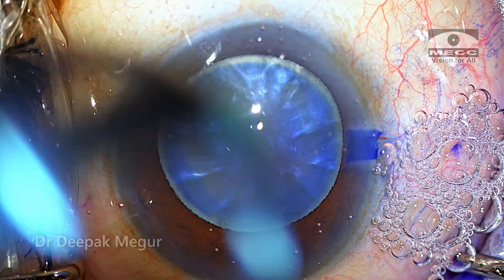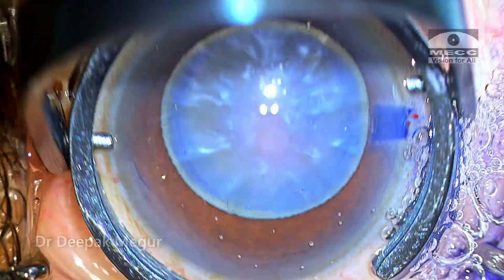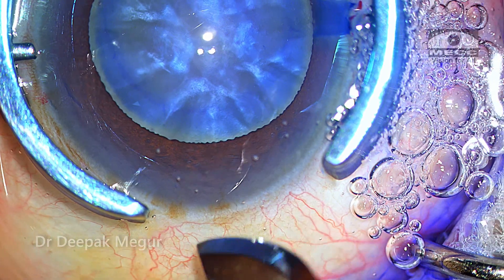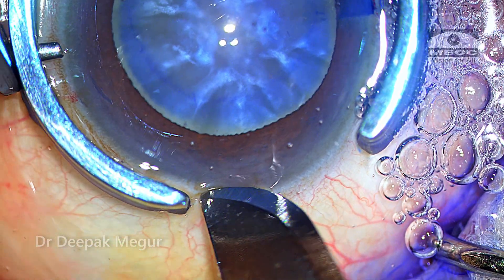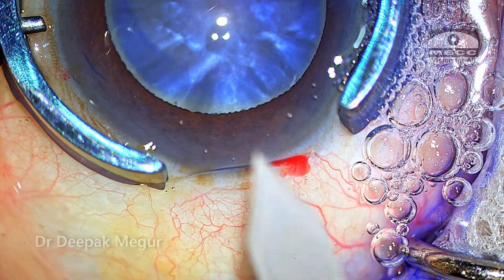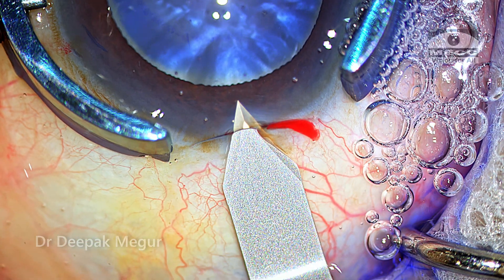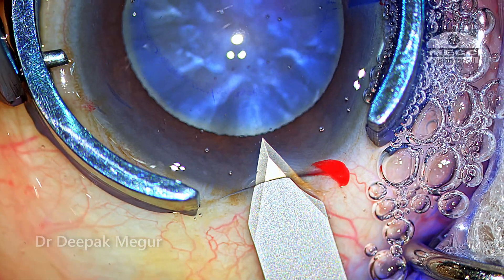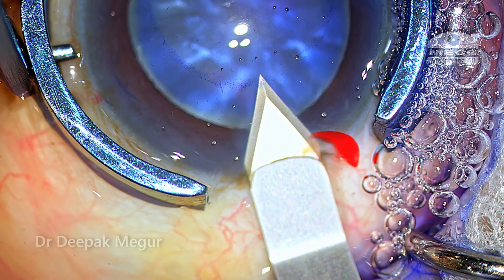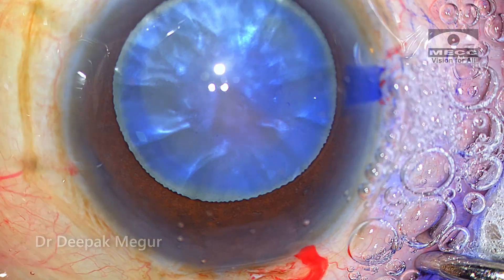Time to create the main incision. The globe is stabilized using the globe stabilizer and a posterior limbal vertical incision is made. When I see these bleeders, it's a good sign — the healing of the wound will be much faster. A 2.8 mm incision is created, and the internal entry is about 2 mm into the cornea, which gives the valvular nature to this wound.